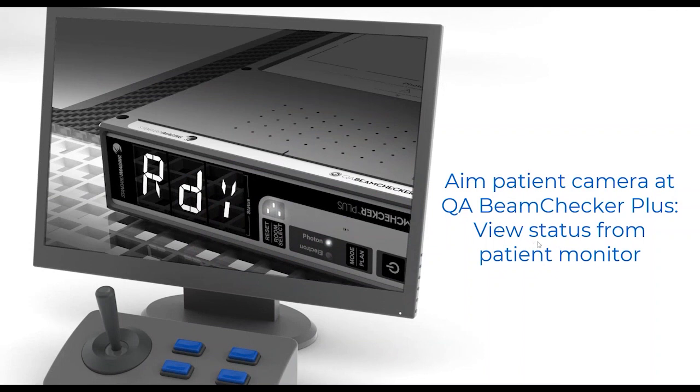Then moving into the control room, you'd simply aim the patient camera at the BeamChecker Plus and see the face of the device and check the status. In this case, you turn it on when you're in the room and it says ready, RDY. It's all set for your measurements. You know by this light that it's on the photon side, and you would have a green light here indicating you're all set to go.